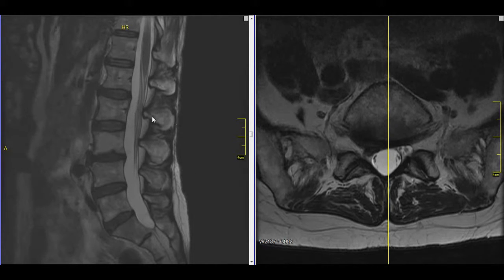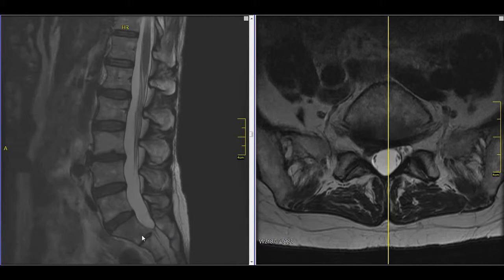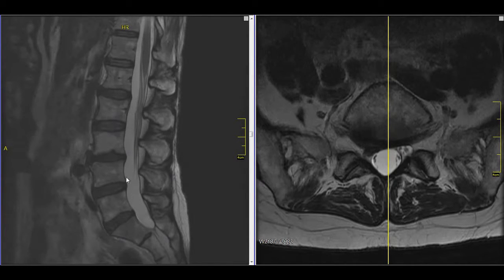We'll start again on the left here. These are the profile views, looking at the person as if they're standing and facing this way. So this is the back, this is the spine, these are the vertebral bodies, and the discs — which are made of cartilage — are these spaces between. The nerve space, again, is back here.